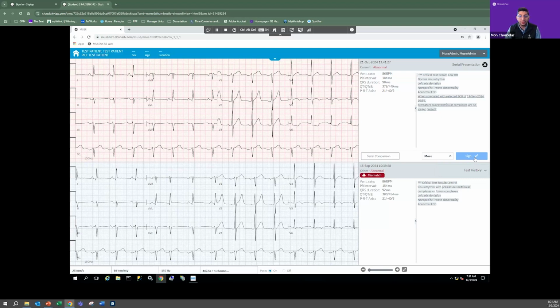They do not use our algorithm. For that, we're working on a different solution, which requires a little more work upfront to make sure we understand the algorithm and understand the findings.